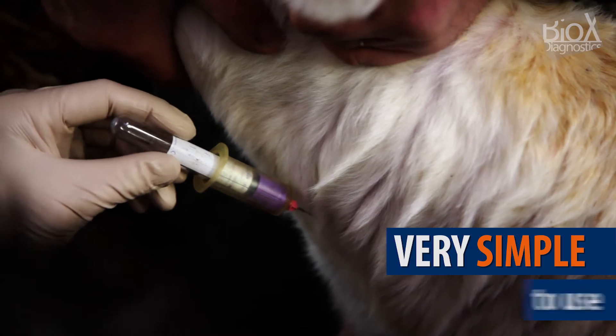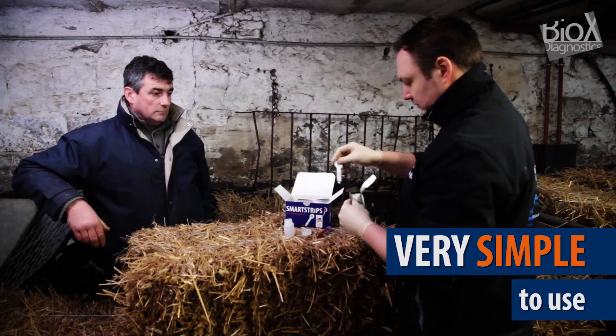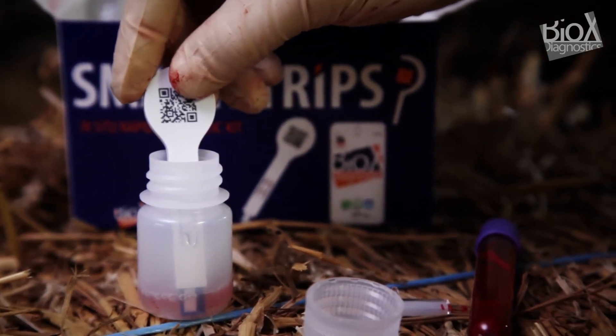The test is extremely simple to use. Collect blood as indicated and dip the strip in the solution. Simple, yet revolutionary.